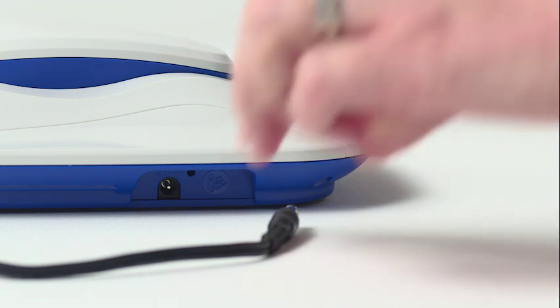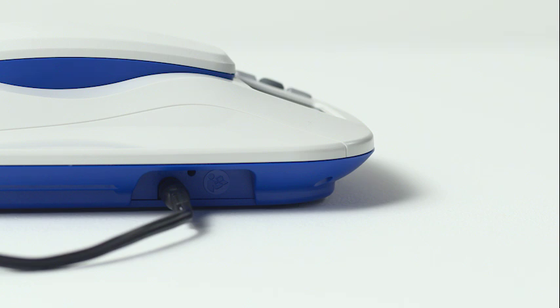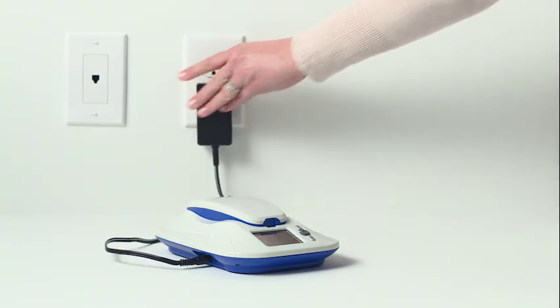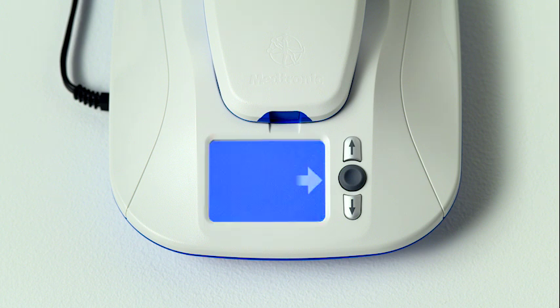Using the power cord that came with your new monitor, plug the circular end into the jack on the side of your monitor and the other end into the wall outlet. Once powered, the animated display screen on the monitor provides easy-to-follow step-by-step instructions.